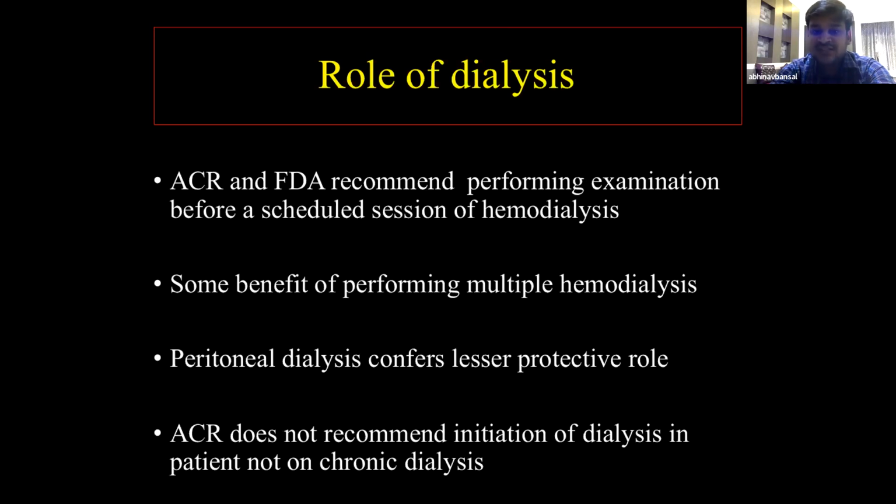However, the guidelines are only for a patient who is on long-term dialysis, and ACR does not recommend initiation of dialysis in a patient who is not on chronic dialysis. So only if the patient is already on dialysis, then the scan should be scheduled to be performed just before a session of dialysis.